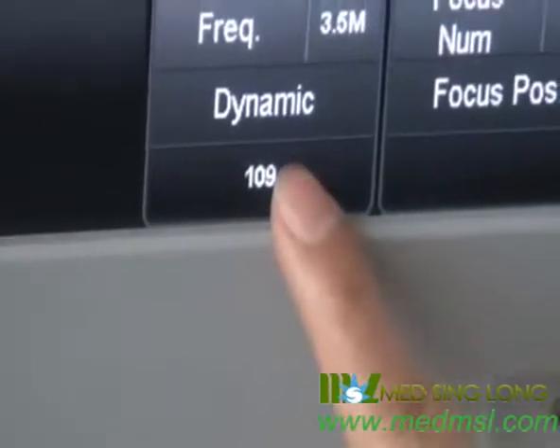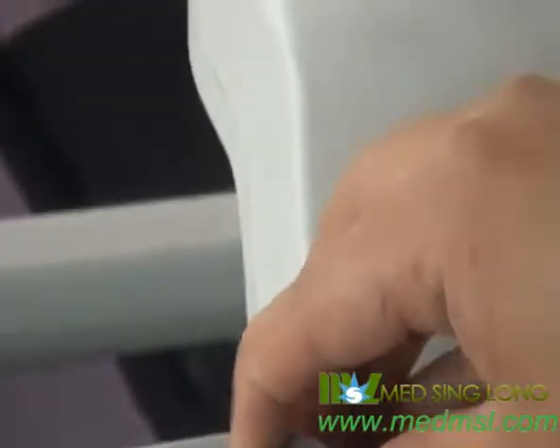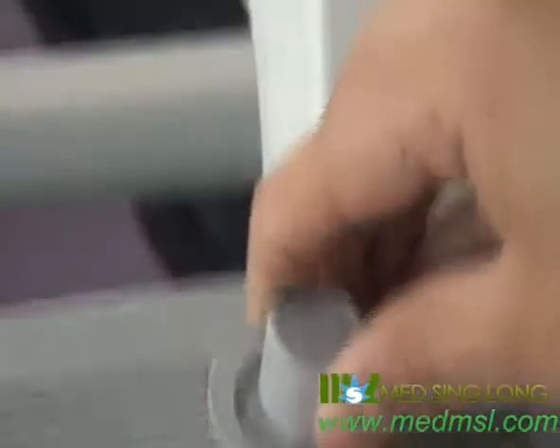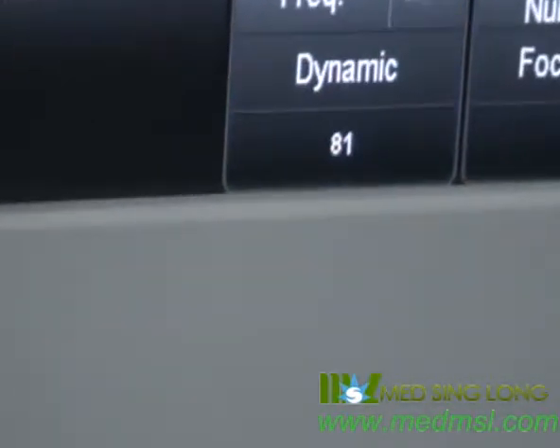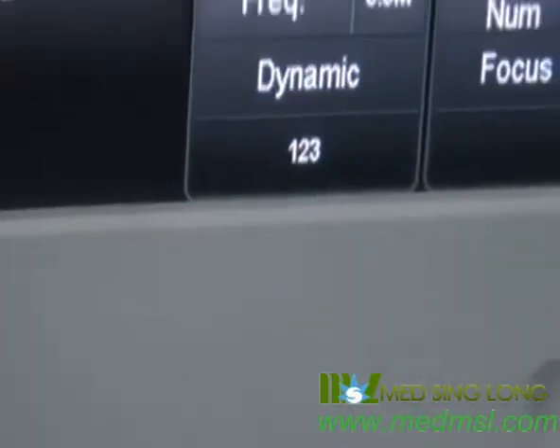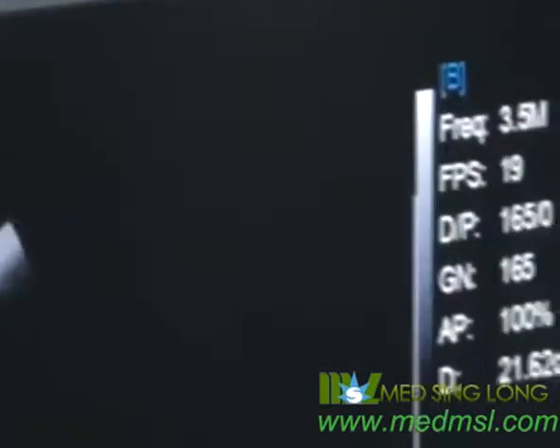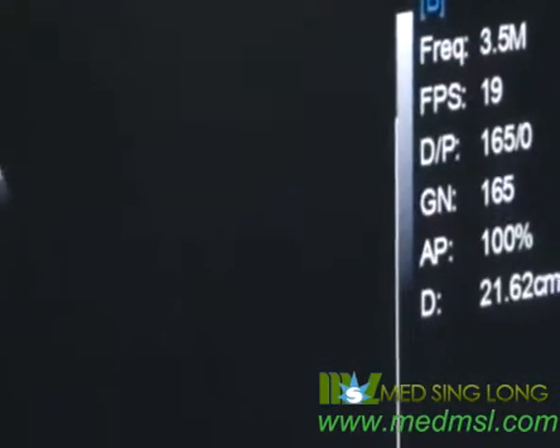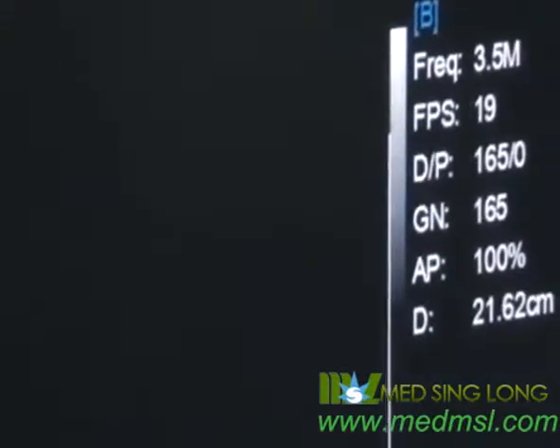For dynamic, rotate this knob to adjust. Dynamic controls the image contrast. If we want to reduce the contrast, we should rotate the dynamic knob up, just like this.